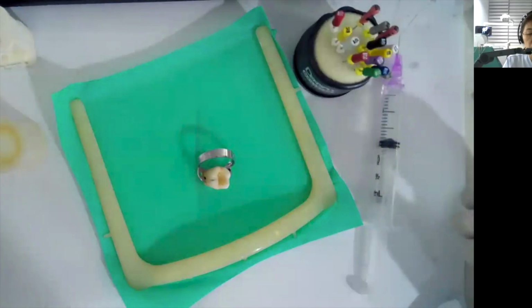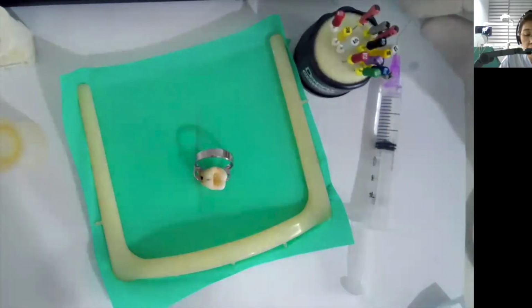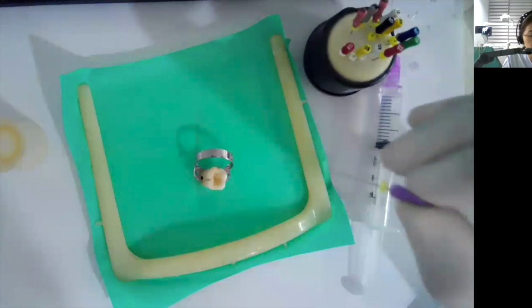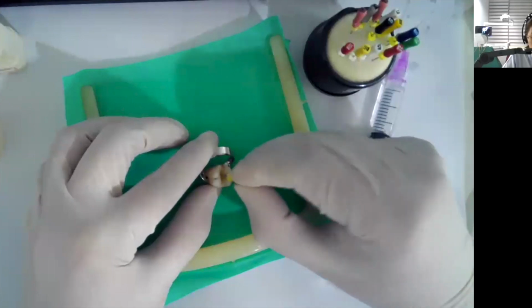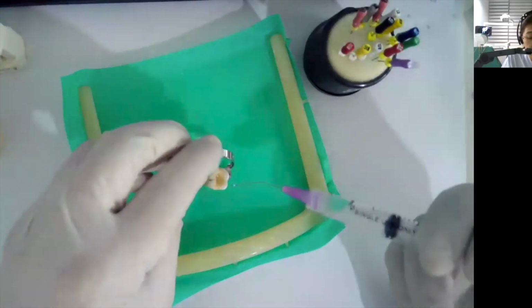Now, I'm going to start with the distal, which is the last canal. So I started with size 10 here. It's 22.5. So I'm now putting it on the distal. Okay, so as I've said, when it's loose, I do push and pull. Irrigate again.